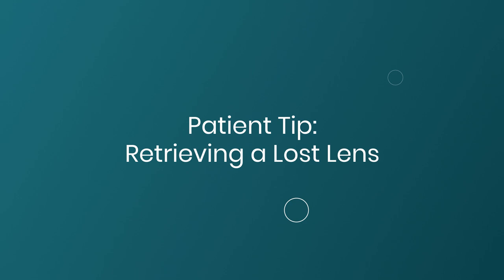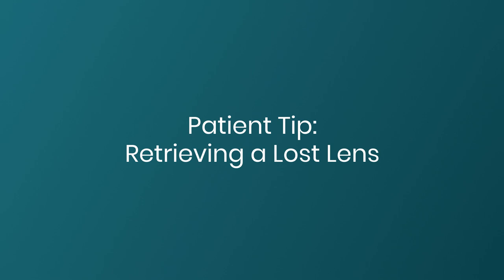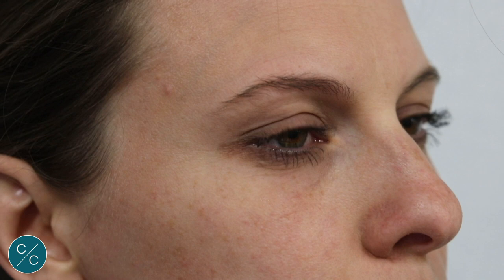We should never let the patient leave the practice without being shown how to retrieve a lost lens, should the lens become dislodged during wear or upon insertion. What we'll show now is the lens being deliberately put in off-centre in the upper fornix. The patient is then instructed on how to move the lens around through the lid into the lower fornix, and then push it back into place using the lower lid as before.